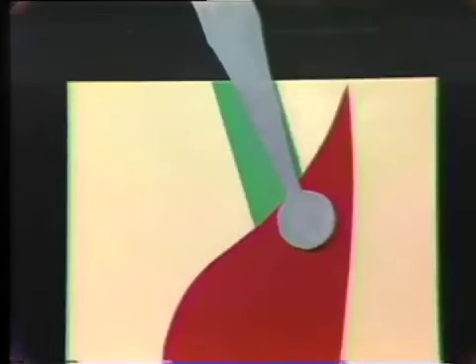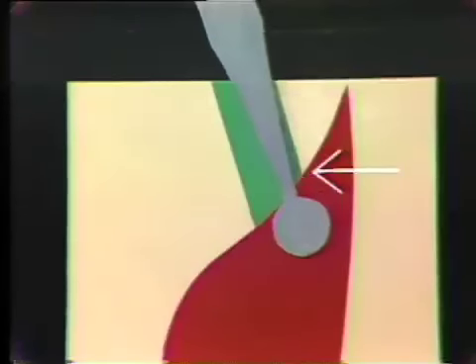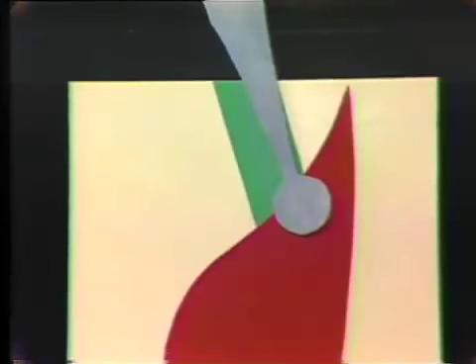As you withdraw the burr from the channel that you made, you'll hit a bump as you hit the roof of the pulp chamber. When you feel that bump, you know that that's where the pulp chamber starts. You can do that in the other direction too. That's where the roof of the pulp chamber starts. When you feel that bump, you want to start the handpiece running again, apply pressure to that area of the roof, and bring the burr right on out, removing the roof of the pulp chamber working from the inside out. Now let's return to the model.